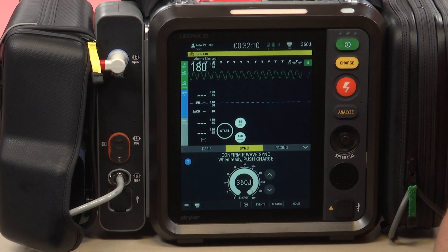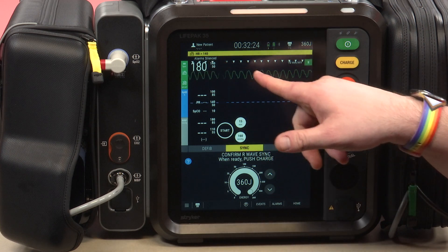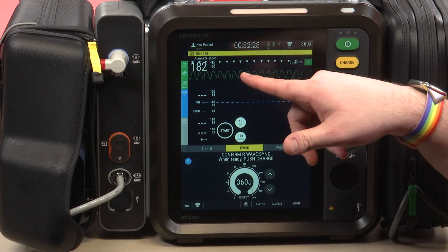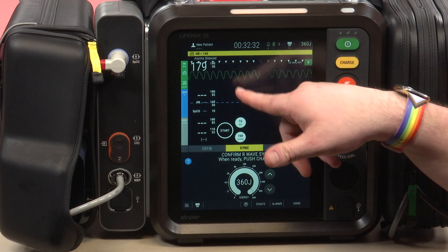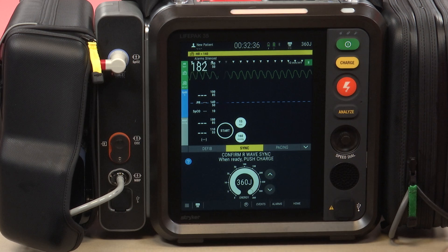No longer do you have to press the button like you do on the LifePak 15 to synchronize, which could be dangerous because some people might forget to press that and instead of synchronized cardioversion, actually defibrillate a patient. The LifePak 35 automatically does that, but we should always confirm at the top of the screen that we're getting those triangles for synchronized cardioversion with every R wave on the screen.